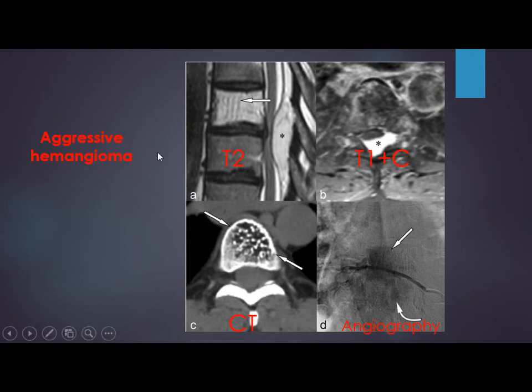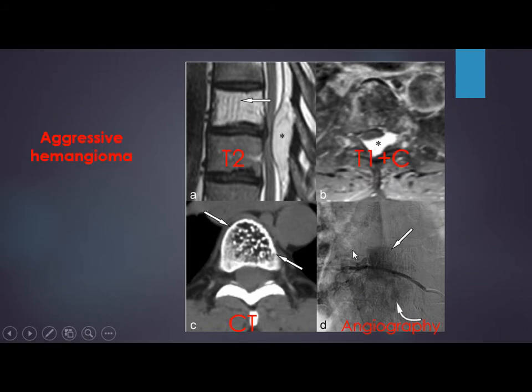Hemangioma could be aggressive. On T2 there is high signal and an epidural component, which enhances on T1 with contrast. On CT, we see the polka dot appearance, and on angiography, the vascular nature of the mass is demonstrated.